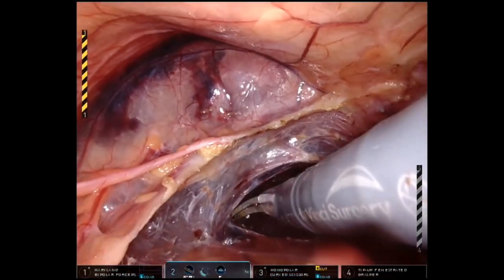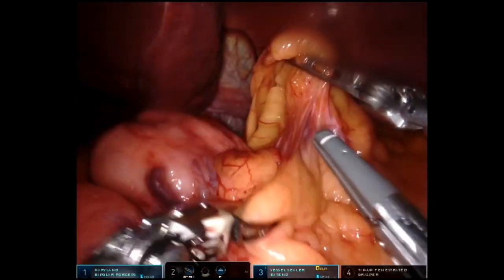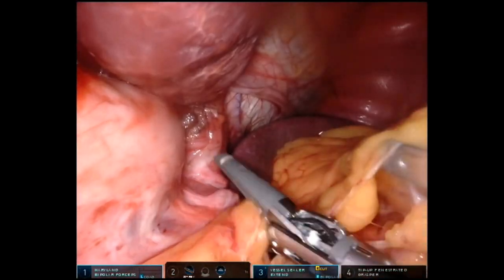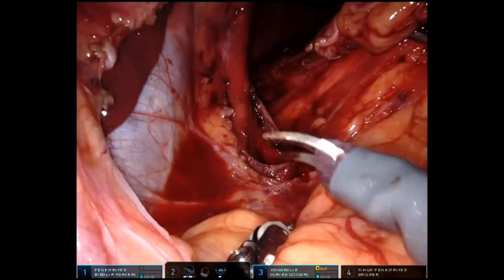The hernia sac is down, heart is up, and screen left is the right lung. Now we're taking down the short gastric, which is the fatty structure between the stomach and the spleen. It holds some blood vessels, so we're using a vessel sealer device to minimize bleeding during this.